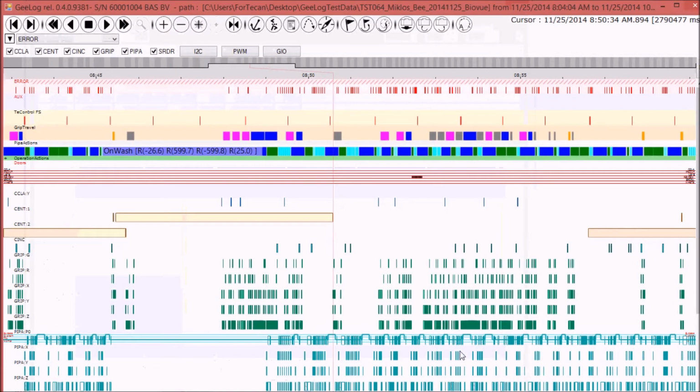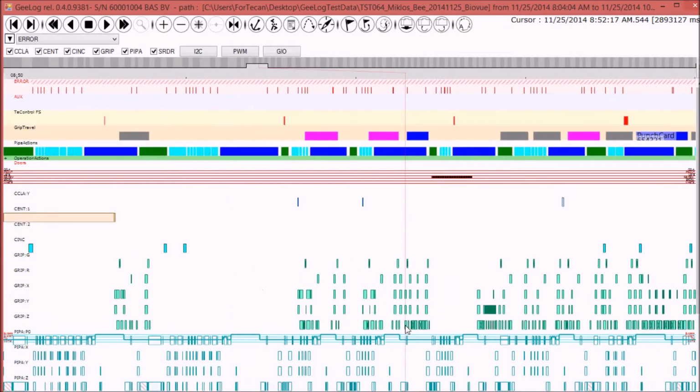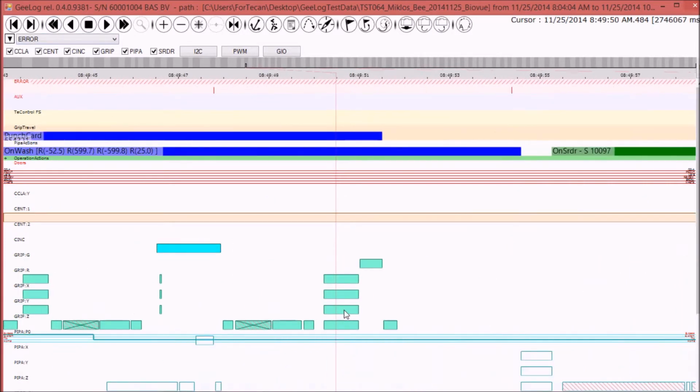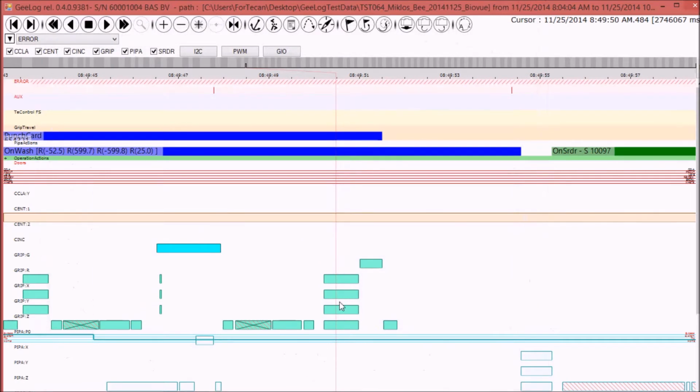Of course, we can have much more complicated profiles. As you can see, the user experience is quite easy. We can easily zoom in and zoom out or pan the window on screen, and for instance show even much tinier moves with respect to the one before. This, for instance, is a much smoother move composed by 2 sinusoidal profiles and a rest period for synchronizing probably with other subsystem of the same arm.